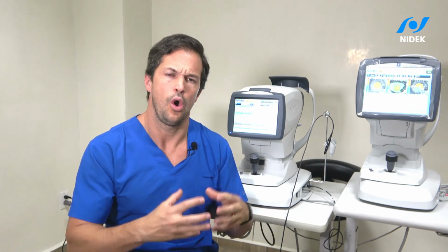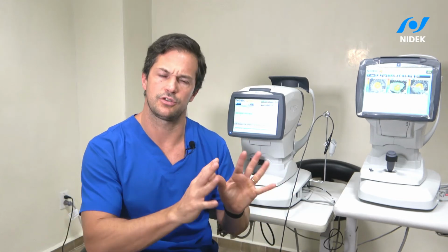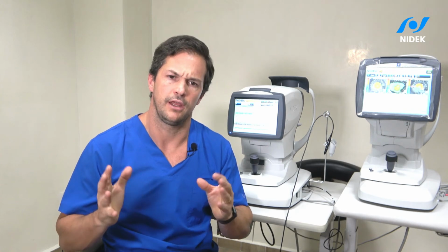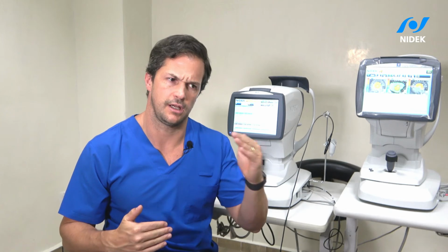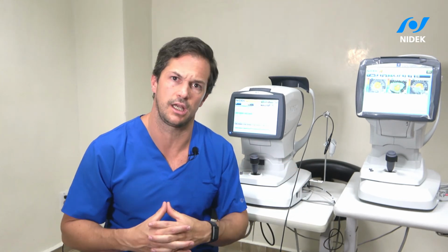Actually, you can also train your patients and educate them on why it's important to have this or that technique, because they can understand clearly what's going on in their endothelium. I think it's also very important for you to measure your results between the pre and the post-op to see if your surgical technique is correct.